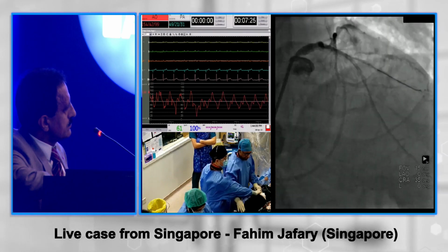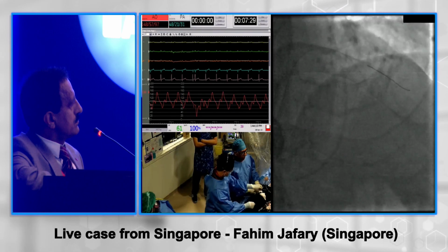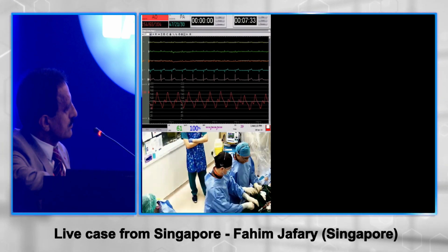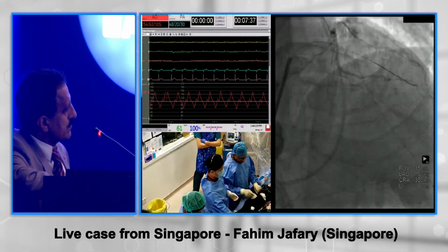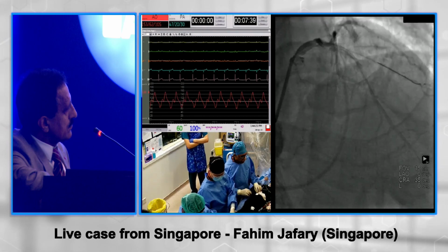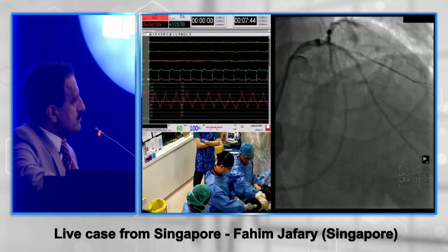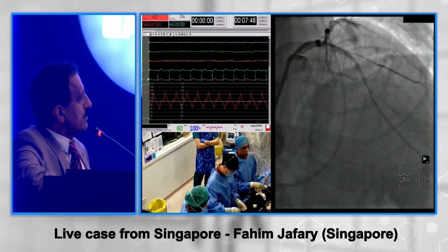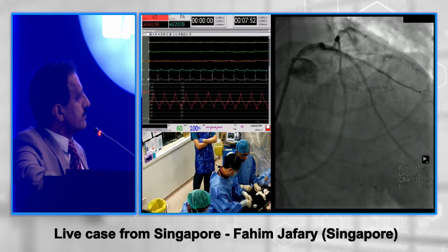He's relatively elderly. Unless my hand is forced, I don't think that I want to put a stent in that diagonal. He is quite ischemic. As soon as we went up with the IVL, his ST segments went up. I don't know if you guys saw that or not. So clearly he is quite dependent on this LAD. But other than that, his pressure is holding. His PA diastolic is 20, which is pretty good.